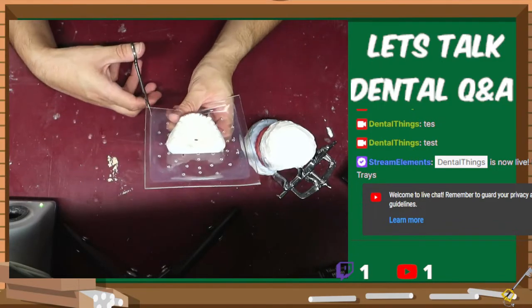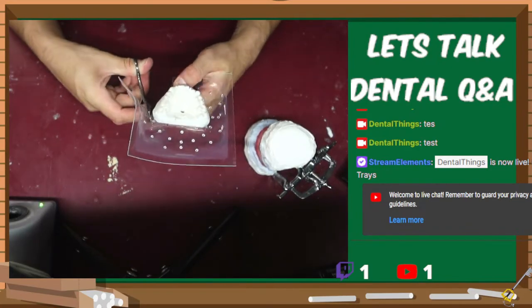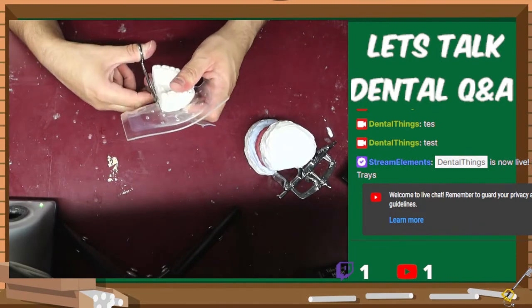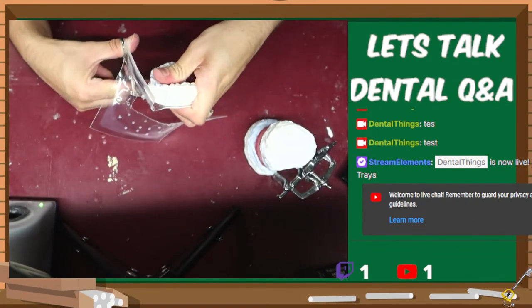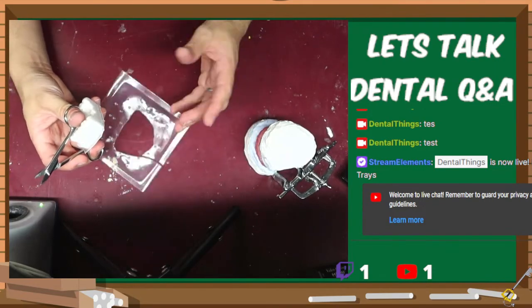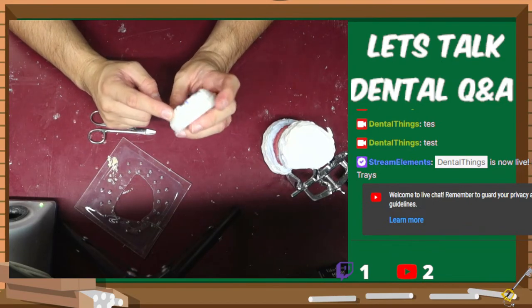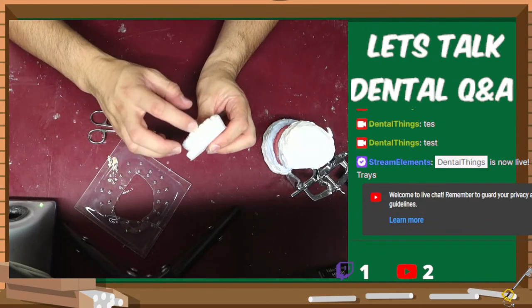So with that, now we just gotta go and cut this away a little bit. Cut. So now this is just all garbage. And now I'm specifically just working on the part that's right here on the mold. Now, because I want to take advantage that it's already on here, I can make some lines on here to guide me as I cut.